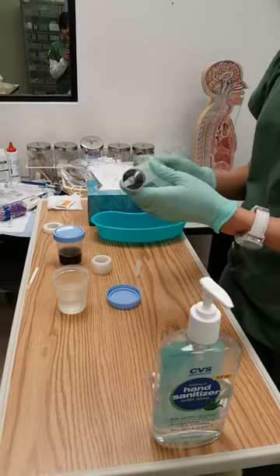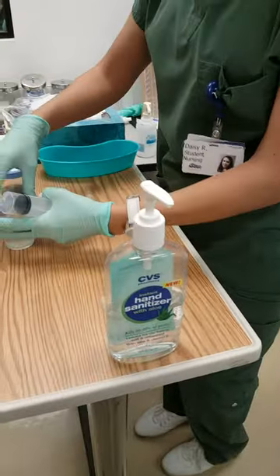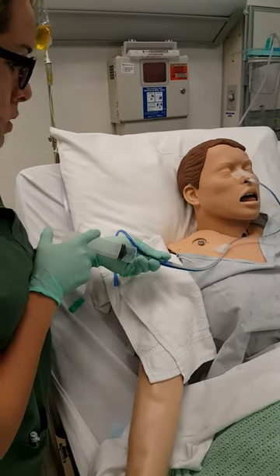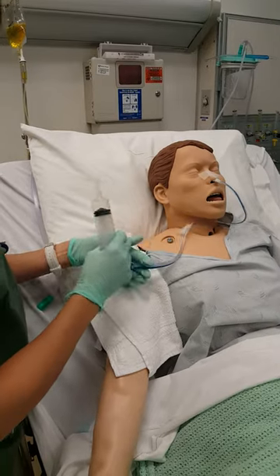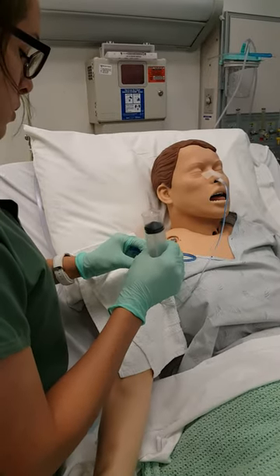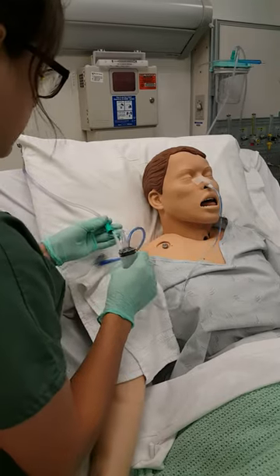So I'm just gonna get 10 to 20 cc's to irrigate the tube, since it is in the right location. So I got 20 to irrigate it. I'm gonna put 20 cc's in here — it might feel a little cold, okay? And then I'm gonna put some air, 10 to 20 cc's.